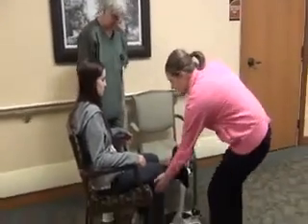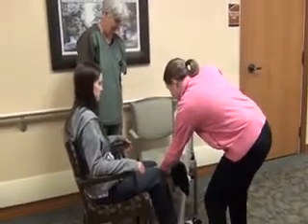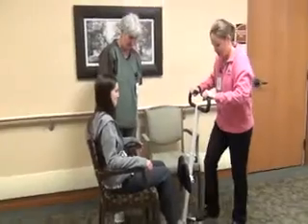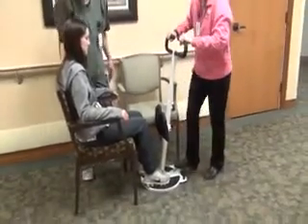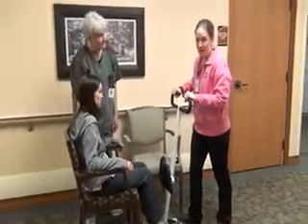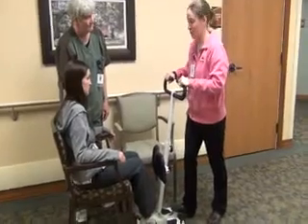The first thing is we want to make sure the patient can get both of their feet positioned on the disc. At this point, the person operating the disc wants to apply the brake. It's easiest to keep your foot on the brake to make sure that it isn't sliding, and that way it keeps you in control.